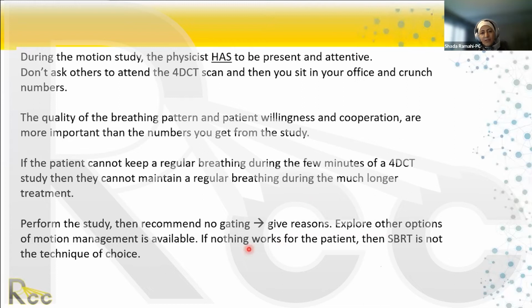So we cannot do 4D CT, we cannot do a DIBH. Let's start chest compression. And everyone needs just to be relaxed. And I know the CT sim therapists will be pulling their hair if they have hair.